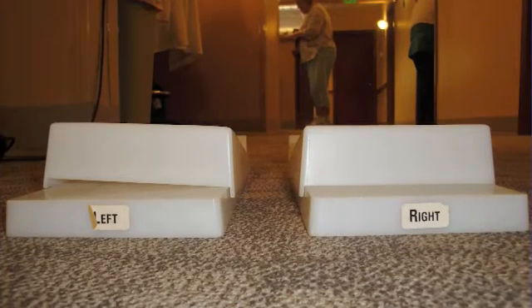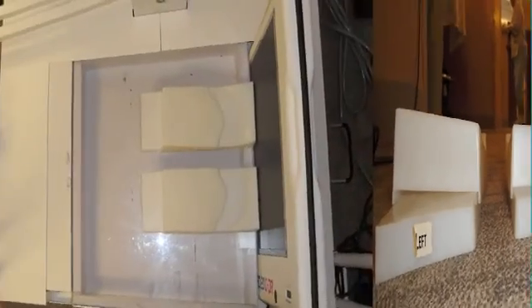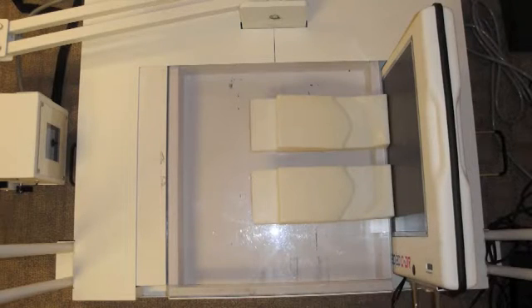These special platforms are labeled left and right, so you will place them with the small immovable slant up against the cassette and the larger sliding slant towards you. Make sure the larger slants are even on left and right, and they are slid up open enough for the toe joint to sit in. You will place the L and R side by side and take them both on the same cassette.